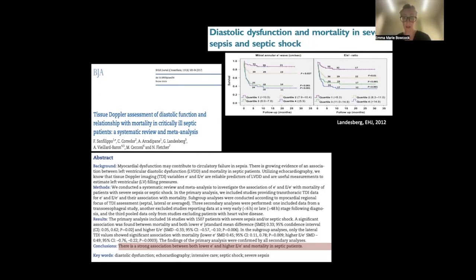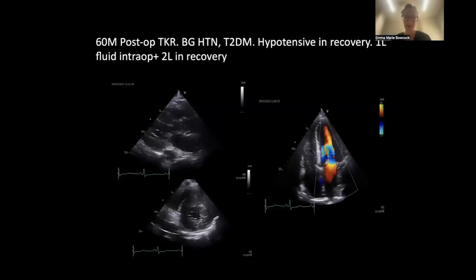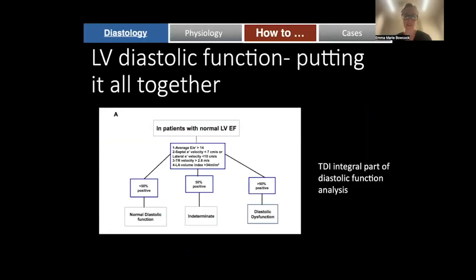So I'm sure you all know. I guess what we do about it is another thing. And I think we might leave it there, guys. There is this final case that I was going to talk through, but we can do that another time. We've got heaps more to talk about on other times. You already got the L wave there. Well done, Drew.